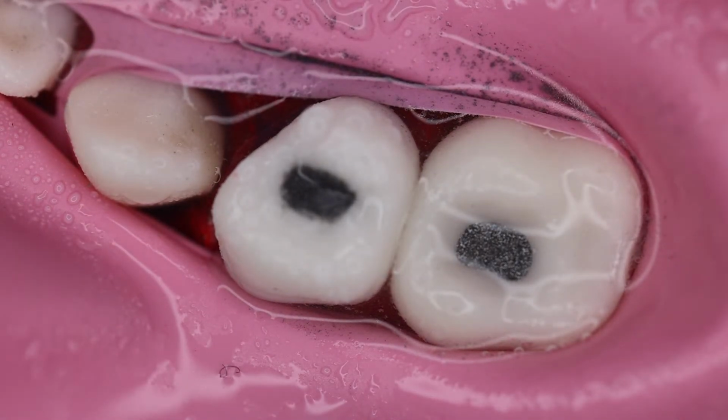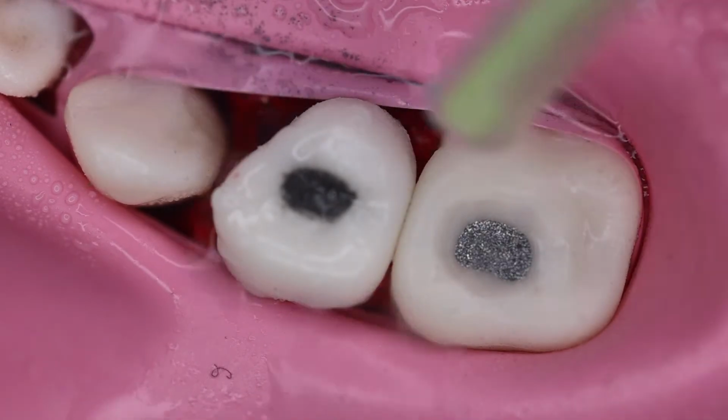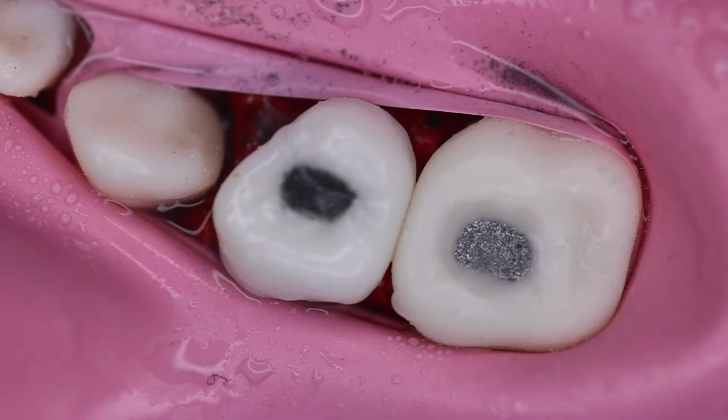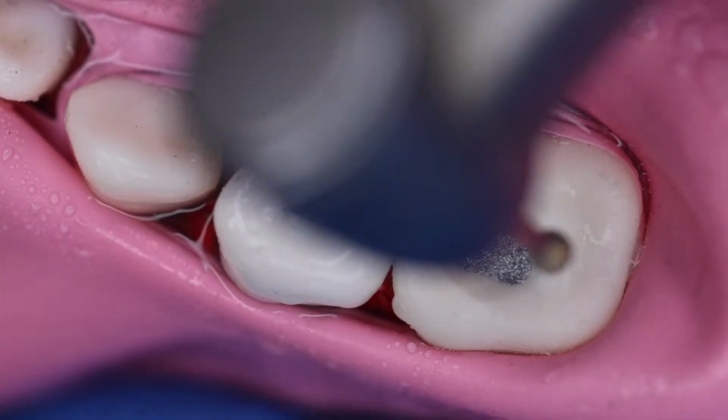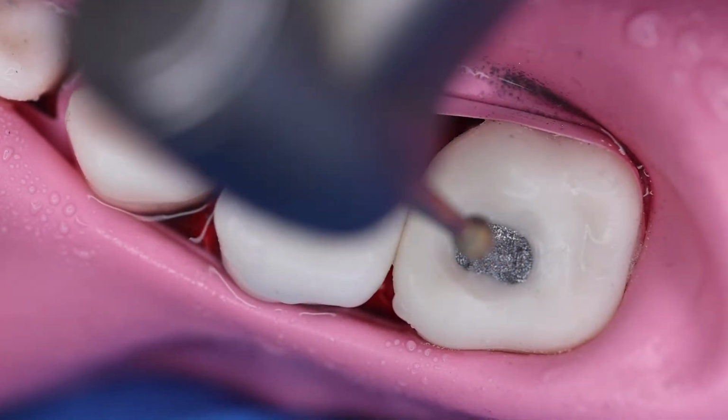So we are removing this caries slowly, step by step. When we have an occlusal pit caries, the caries goes deeply and spreads as the dentine progresses.